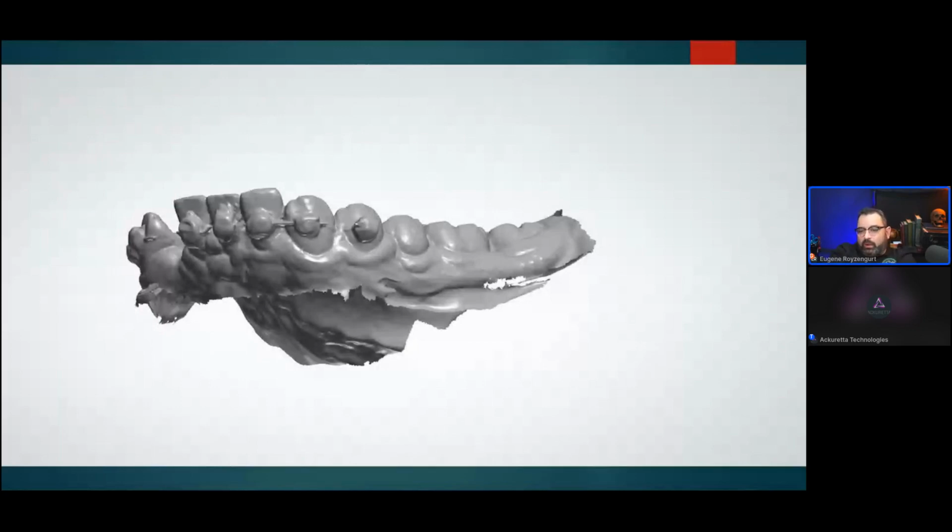So the reason why Cleani uses less alcohol is because it's actually a narrower tub versus a wider one, so it goes up rather than out. I usually put two 32-ounce bottles in each one of the vats, so it allows me to fully submerge the plate all the way up to the handle, and the prints reach all the way down.